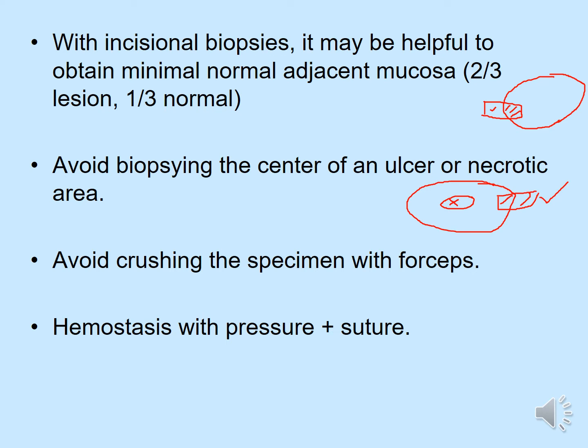The next important guideline is to avoid crushing the specimen with forceps. For the biopsy procedure, there is an armamentarium wherein we use forceps to hold the piece of tissue before you detach it from the mucosa. At that time, it's very important that the operator or the assistant should not use excessive force with the forceps and crush the specimen. What goes wrong with using additional force is that the cells get distorted, and that could lead to a microscopic misdiagnosis.